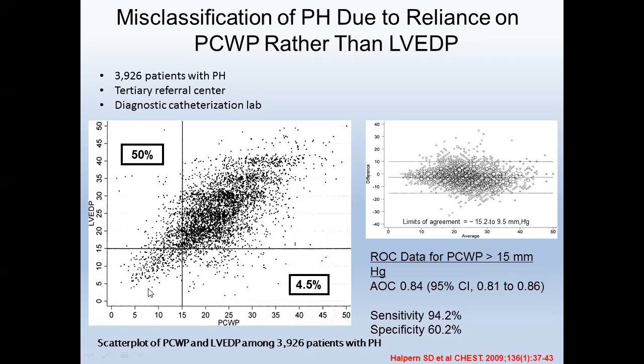So what is the reason for this? Why did they make the mistake of giving a low wedge pressure? They did not measure the end-expiratory. They just went by the computer-generated mean, which is the lower wedge. If they went by the end-expiratory, it would have been higher, which is correlated with LVEDP, which is a common practice, right? We don't look at it and say, oh, the computer-generated text captures it, move on.